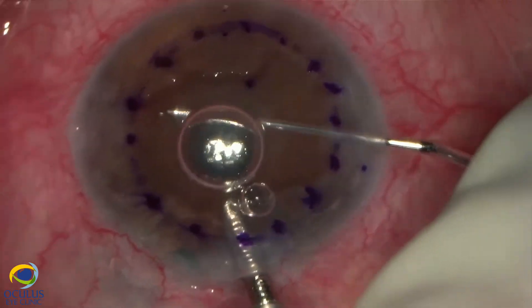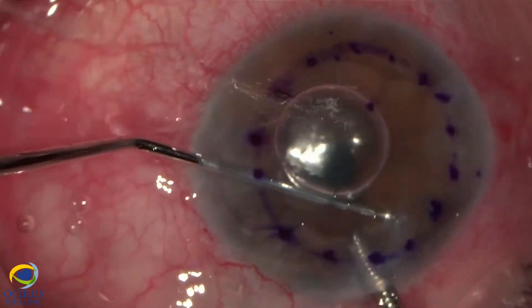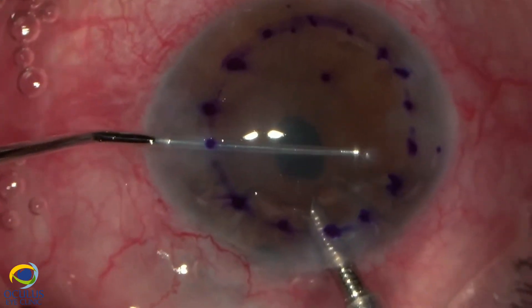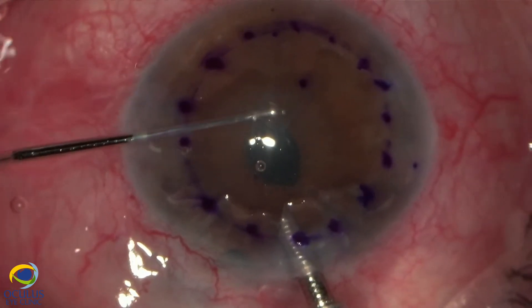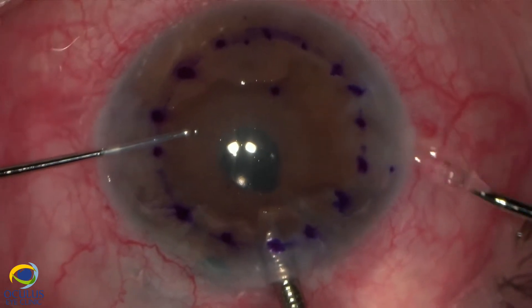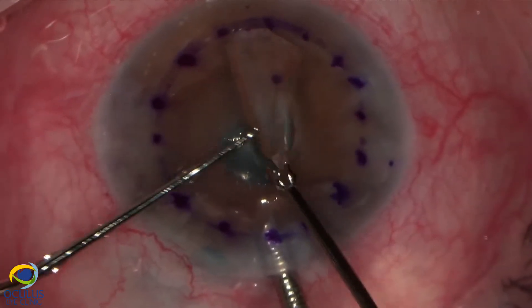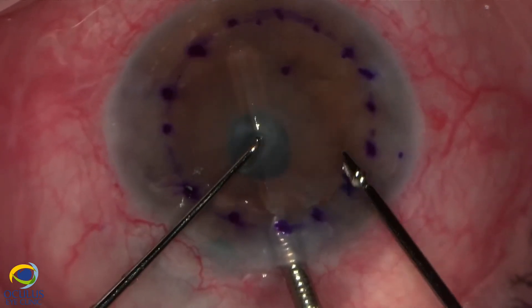Again, the air has a tendency to escape, but we continue the descemetorhexis under BSS. One can choose to inject OVD in the anterior chamber, but I prefer to avoid using OVD in all lamellar procedures in order to have safer attachment of the graft. I managed to remove the Descemet membrane in one single piece.